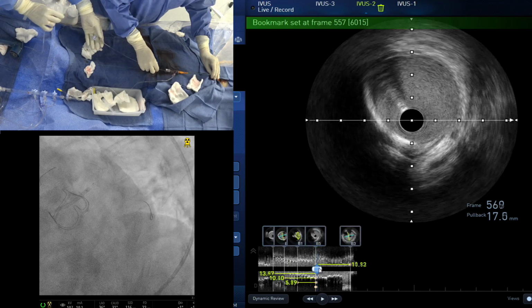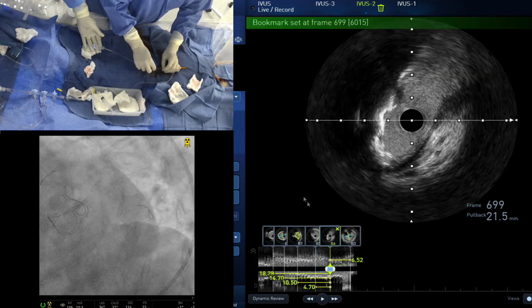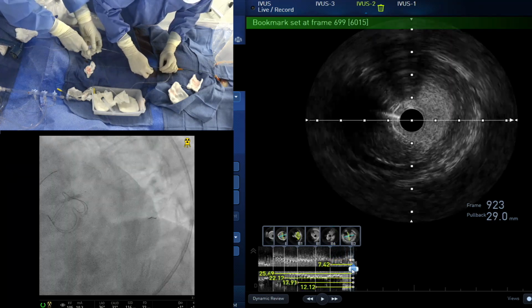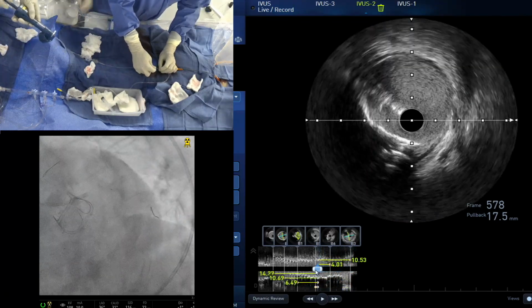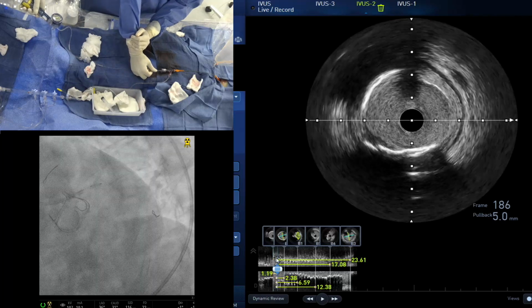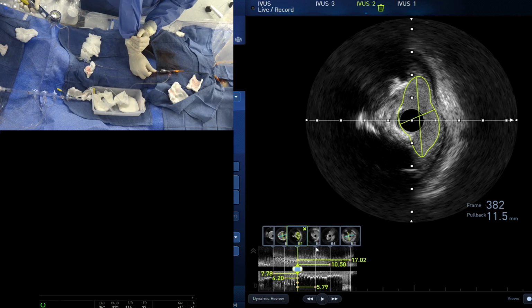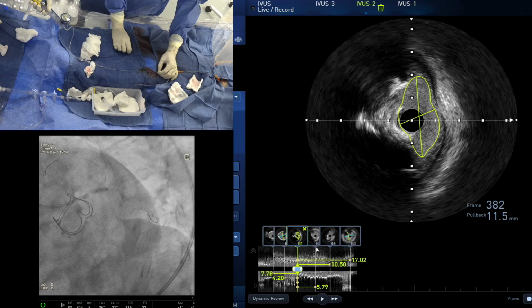So this is a cutting balloon, the Wolverine, still not making the turn into this calcific lesion, but let's do it here and then we'll make it. Yeah. So once the nose is there, you can do it, and that's exactly what we're trying to say. Okay, good. Go up. We just got more wire purchase and then we are able to get the 14, 16. What is the size? It's a 3.0, because remember the lumen right now was 1.98 and the overall vessel of the circ is what, 3.5? What is it?